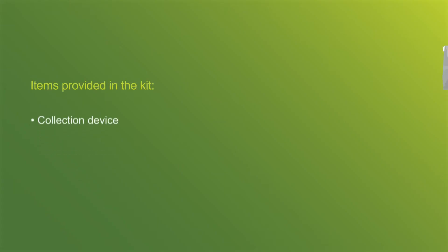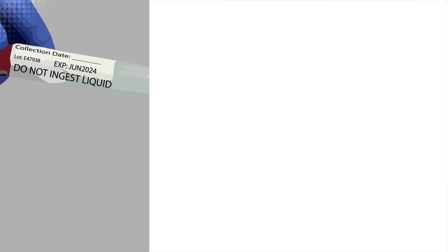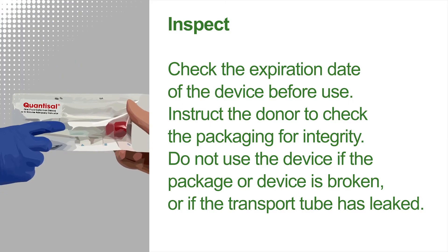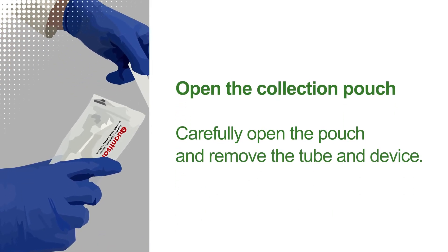Included in the kit are a collection device, transport tube, and package insert. A timer is not provided in the kit. Check the expiration date of the Quantisal device and the integrity of the packaging before use. Do not use the device if the package or device is broken or if the transport tube has leaked. Open the pouch and remove the tube and collection device.